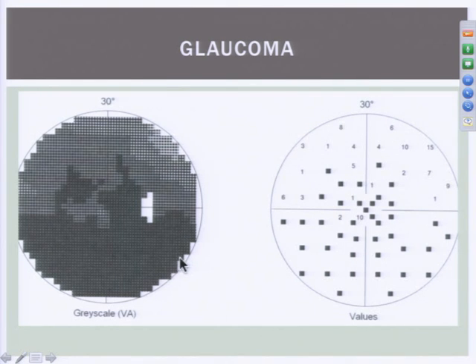So when they go to walk around, they can't see the floor. Because all they can see is the ceiling, which really isn't all that helpful when you're walking around. You don't bump into light fixtures, but there's a lot more to bump into on the floor. So we can use a prism in this case to basically shift their vision down, so we bring the part of the visual field up here that's functioning more into play.